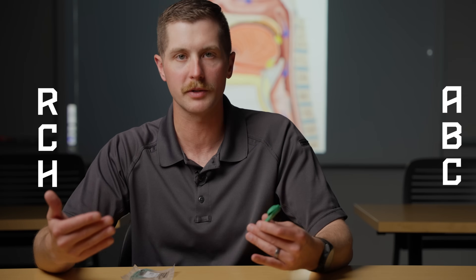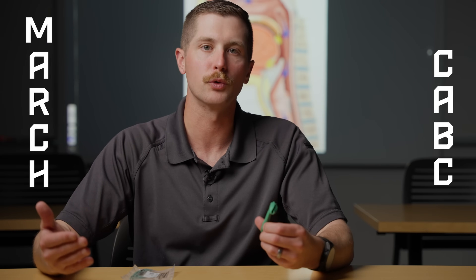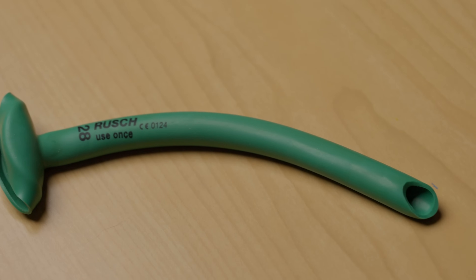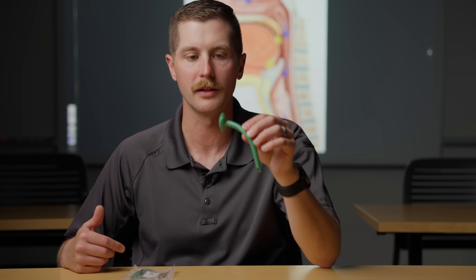If a patient is unresponsive or has an altered mental status, especially if they are on their back on the ground, you might hear snoring respirations. When you hear snoring respirations, that is a clear sign that their tongue is starting to obstruct the back of their throat and hinder the air exchange to their lungs. An NPA basically mitigates that and bypasses the tongue, allowing for clear communication of air and helping the patient breathe better.